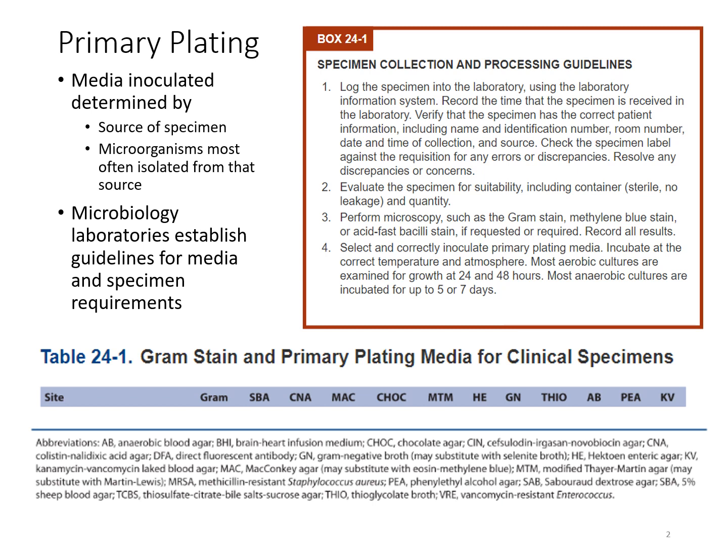Throughout this presentation, I will give you the information that is listed in the textbook, which will include this table that you see on here, where it just describes the various tests that will be performed based on the particular site that the culture was obtained from. So we're going to look at whether or not it typically would have a gram stain and the primary plating media that you would use for that specimen.